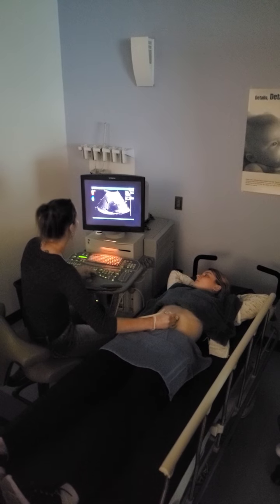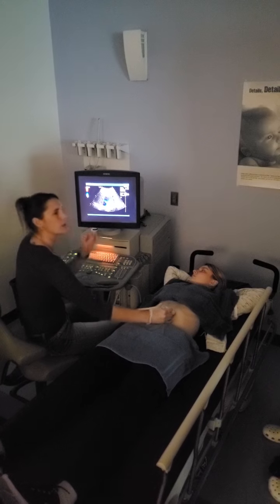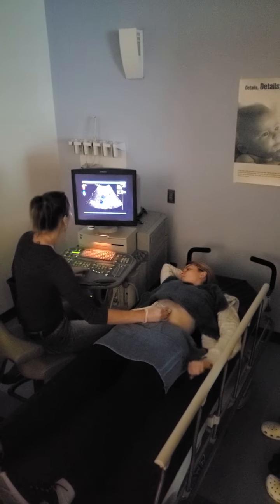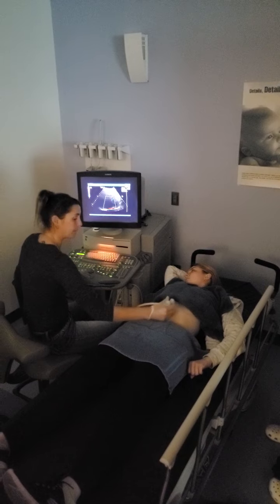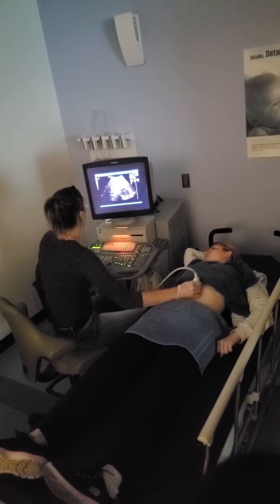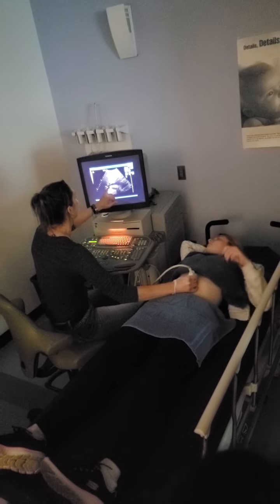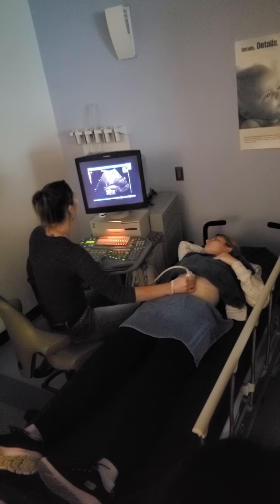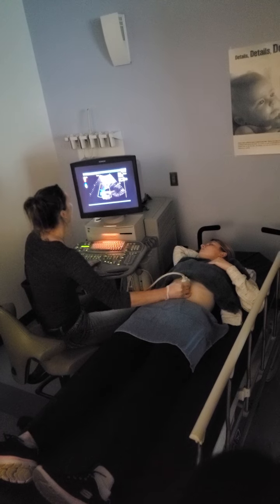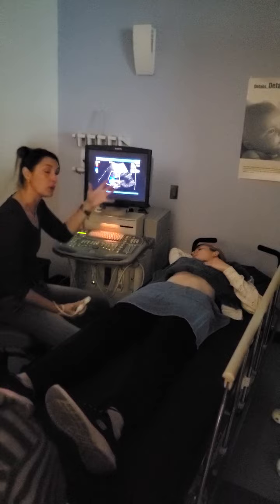But the reason I don't particularly care to do that is I get a lot of artifact from the tissue. The liver itself is moving significantly in there, so it just gives me a lot of artifact around it. And then my super duper fat man backup window is sagittal, big breath in and hold it, just where that hepatic is coming into the IVC. And this one's a little more limited. It has a lot of motion artifact because I'm really close to the heart. And it's limited because I'm only able to see one hepatic at a time. So it's my backup window.